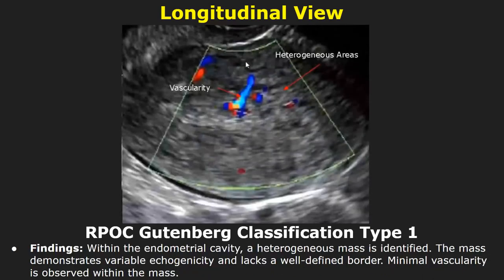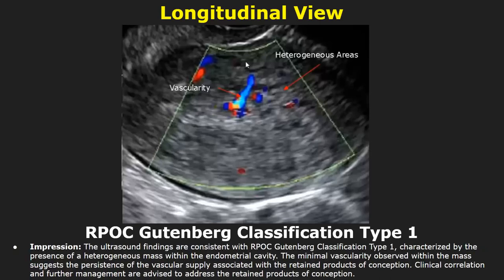Here is a type 1 RPOC. A heterogeneous mass is identified. The mass demonstrates variable echogenicity and lacks a well-defined border. Minimal vascularity is observed within the mass. In the impression, you can mention the type 1 RPOC classification with findings of a heterogeneous mass with minimal vascularity, and in the end you can write about clinical correlation and further management.